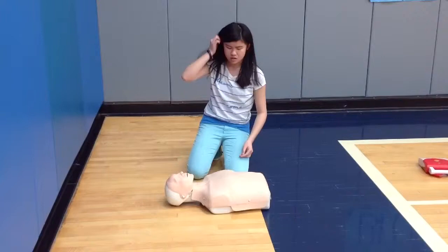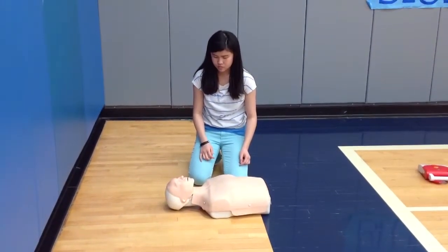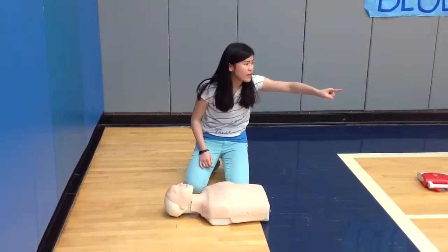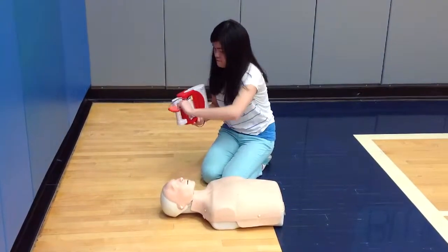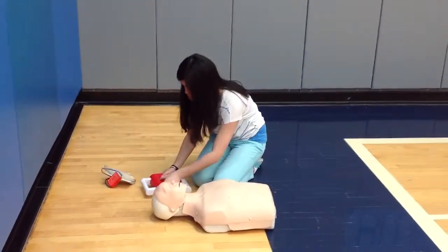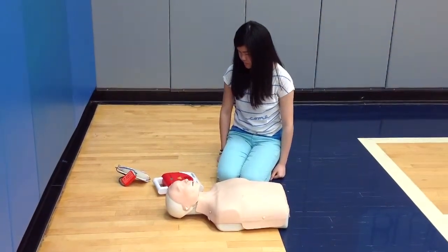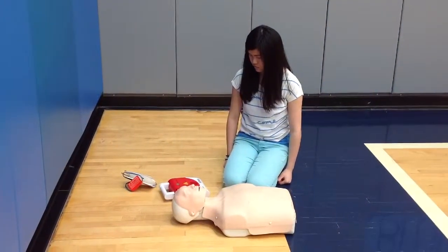If you determine that they are not breathing, then you need to do two things. You need to get someone to call 911 and send someone to go get an AED. You get an AED, you call 911 now. Thank you. Once the AED gets here, you should turn it on immediately and listen exactly to the directions it gives you.